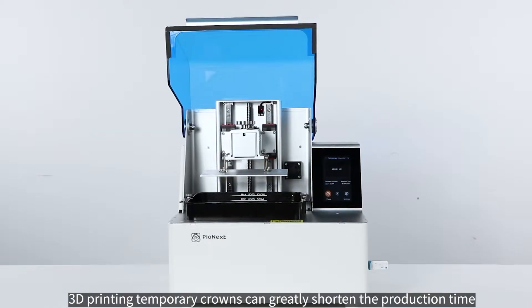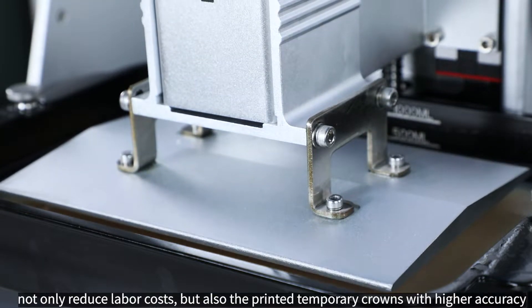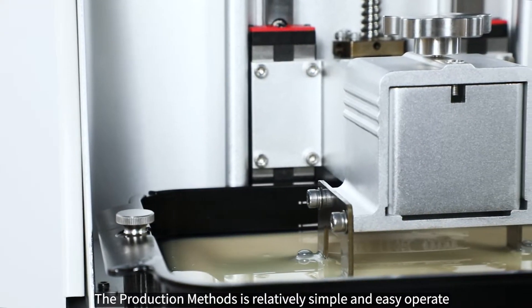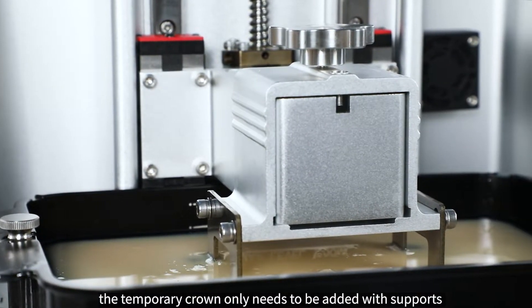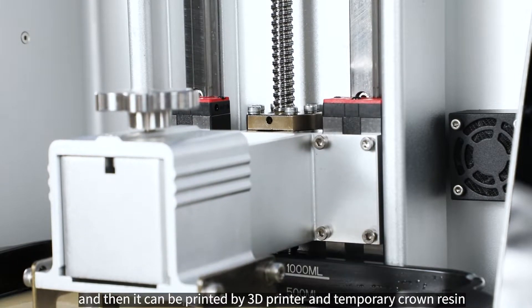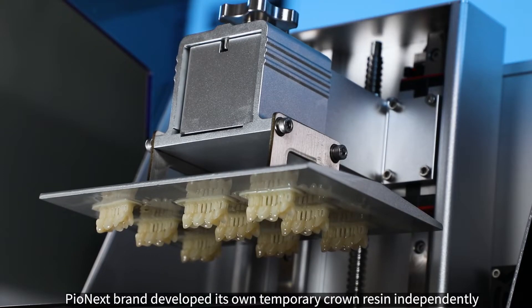With the development of 3D digital technology, 3D printing temporary crowns can greatly shorten the production time, not only reducing labor costs but also producing temporary crowns with higher accuracy. The production method is relatively simple and easy to operate — the temporary crown only needs to be added with supports and sliced after collecting data and design, and then it can be printed by a 3D printer.